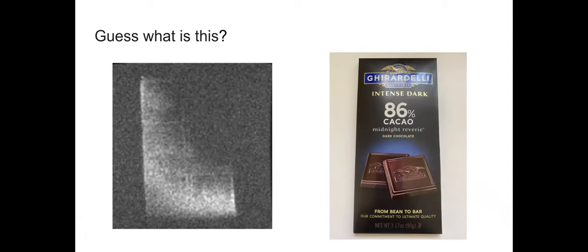With the metal? No, without the metal, that wouldn't give us any signal, right? Maybe. It's like shielding, basically. I don't know. Chocolate is mostly fat. We were wondering why the signal was so low. This was a fast spin echo acquisition.